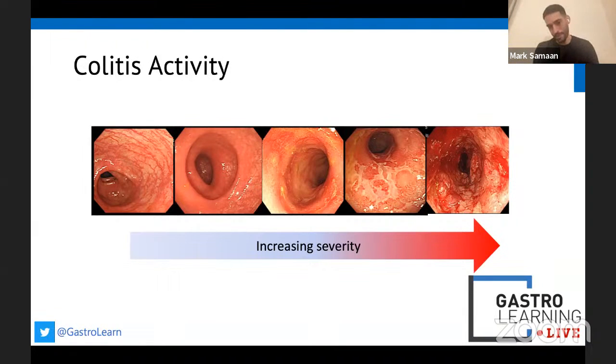It's a really good question. I think the first thing to say is, it does depend on the situation of the patient. If they have symptoms in keeping with acute severe colitis at the time that you happen to be scoping them, you don't want to do a full colonoscopy on them, because the risk of toxic megacolon or toxic dilatation is kind of what everyone worries about. I think we probably egg that in our mind. If this is an outpatient, someone who doesn't have symptoms consistent with acute severe colitis, even if he has a Mayo 3 colitis, like you see at the more severe end there.